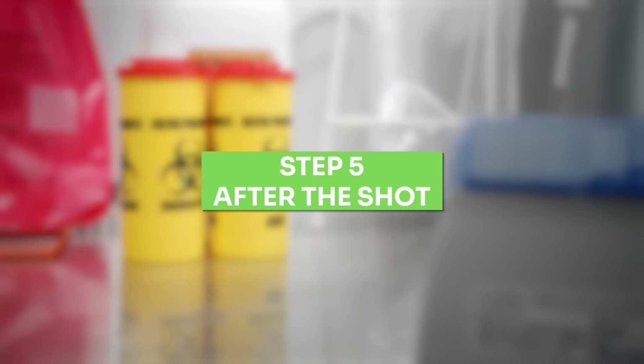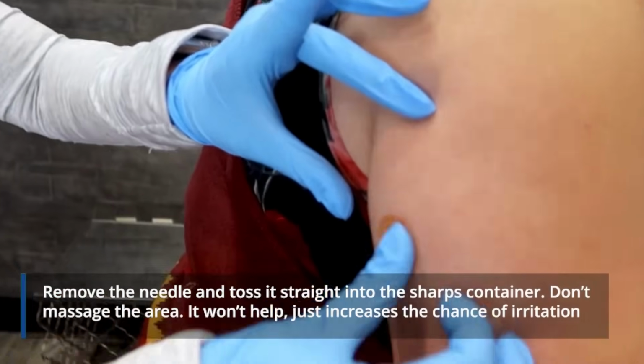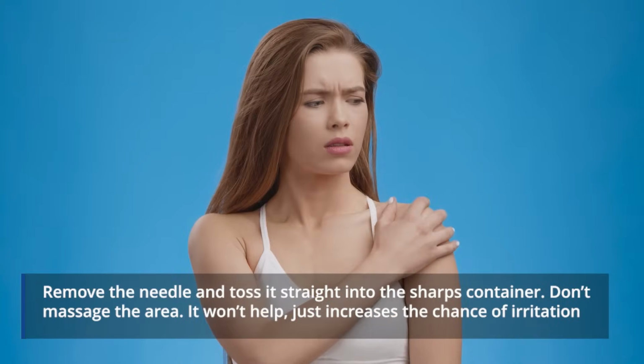Step 5. After the shot. Remove the needle and toss it straight into the sharps container. Don't massage the area, it won't help. Just increases the chance of irritation.